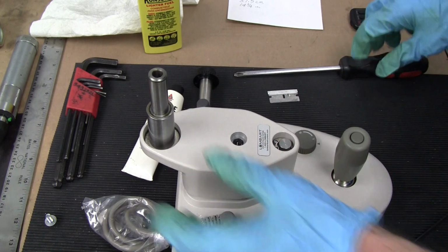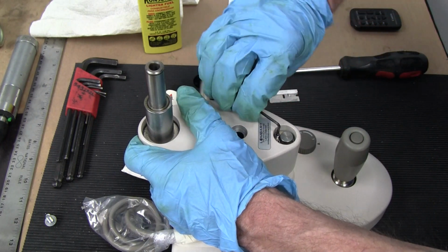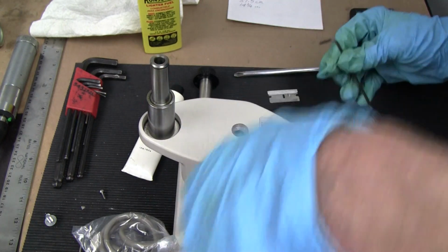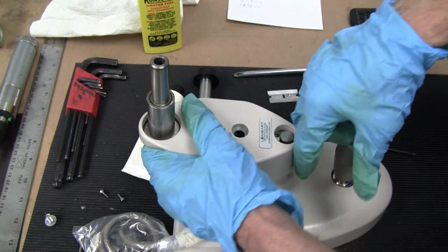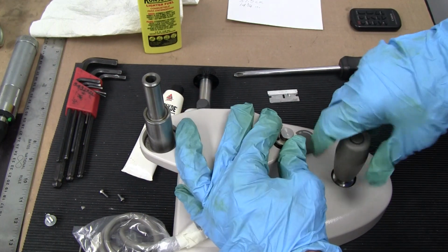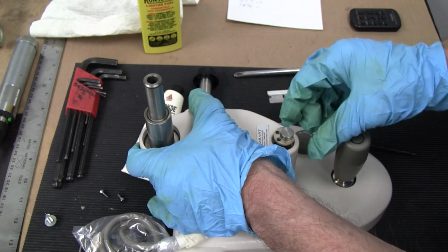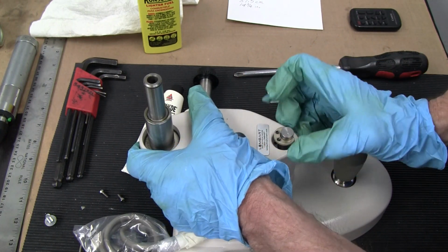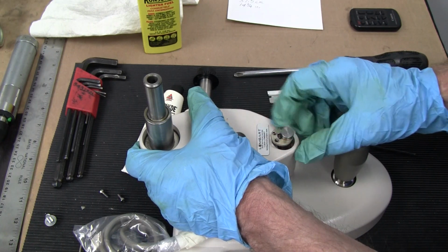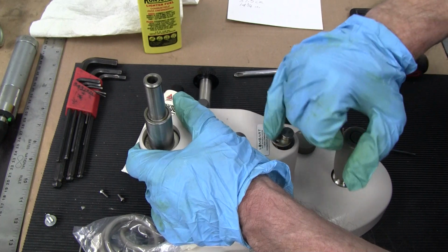Now we can release these. We'll lift up a little bit and remove these two Allen screws, 2.5 millimeter. If we've lifted up a little bit, we can push down on it to get our key washer out. Sometimes these are really loose, and so when you're putting them back together, you might have to squeeze these a little tighter so they fit a little tighter on here. But this one's good. It can move in and out easily, and it's not too loose. If you want to put a mark on there to show, okay, this side was up, you can do that.